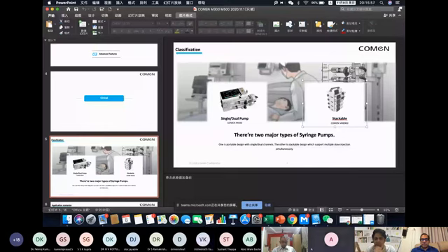Chris, there is one more question. How frequently do you need to get the service done for this? Is there any annual maintenance required for this machine, or how frequently do we need to check this? This machine's only maintenance is cleaning. Yes, Chris. I mean, for this machine, we just need to keep cleaning the machine. That's it.